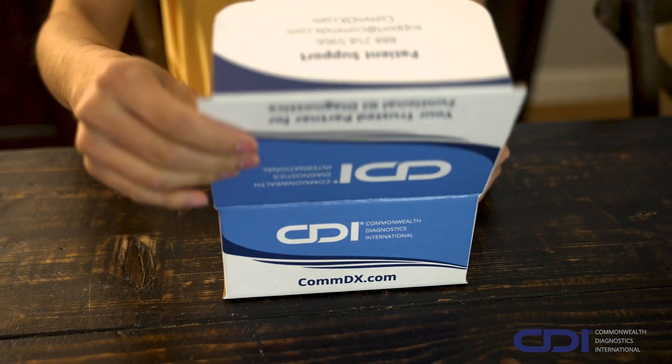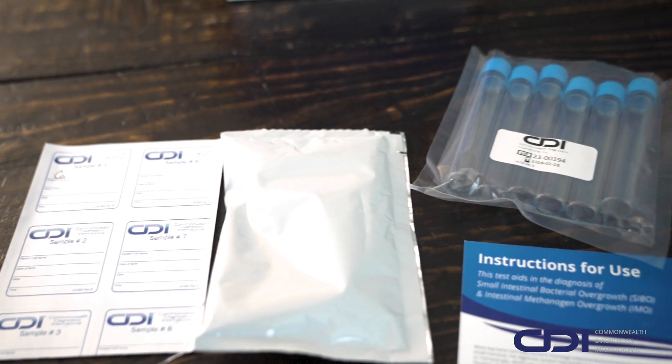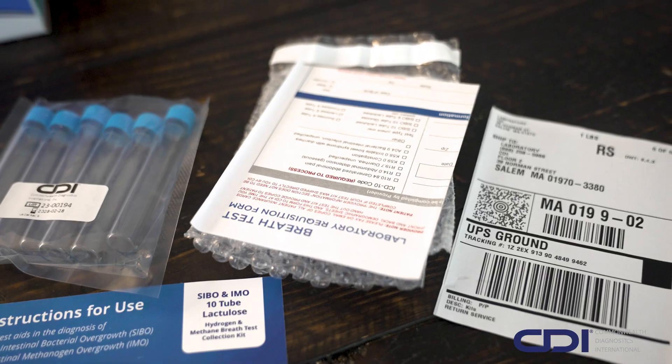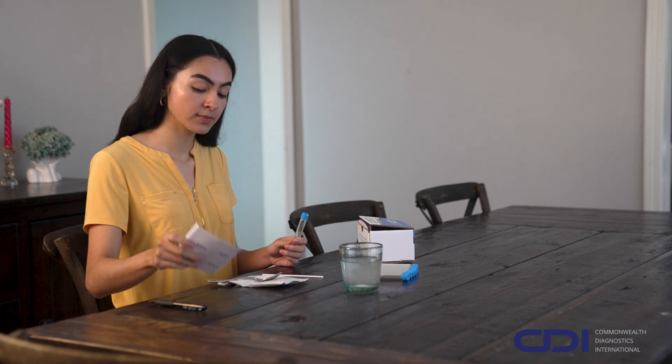Before testing, let's review the contents of your test kit. Your kit includes a straw, substrate packet, 10 or 6-breath test tubes with labels, a bubble wrap packet, a prepaid shipping label, and a requisition form. Be sure to fill out and include the requisition form and other required information when you return your kit.